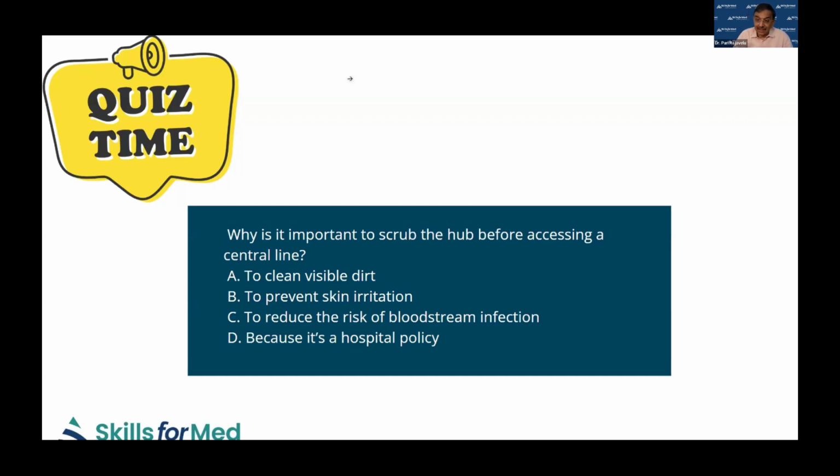Yeah, that's another important point. Chlorhexidine should dry for it to be very effective. Thank you so much for bringing that up. But I'm asking why 5 seconds? Why 15 seconds and why not 10 seconds? Why not 20 seconds? Someone has answered: contact time. Fantastic. You have hit the nail on the spot. Congratulations to you.